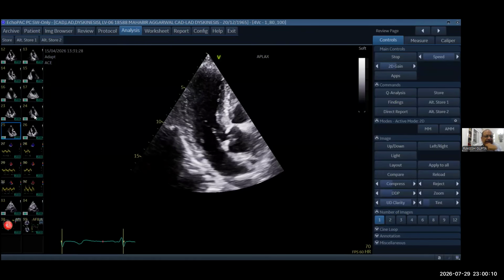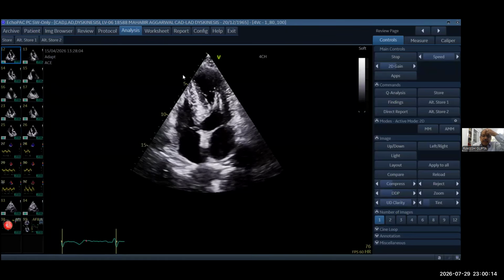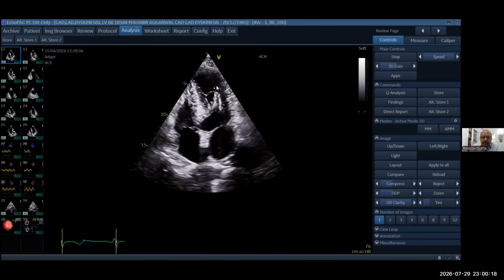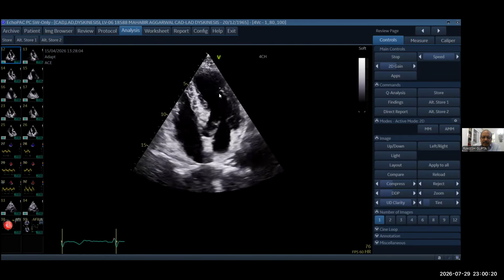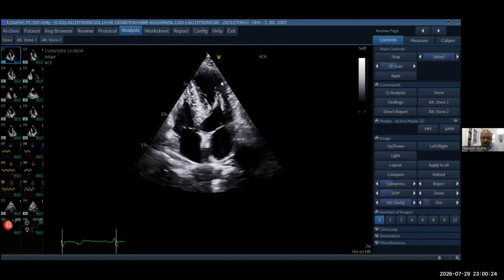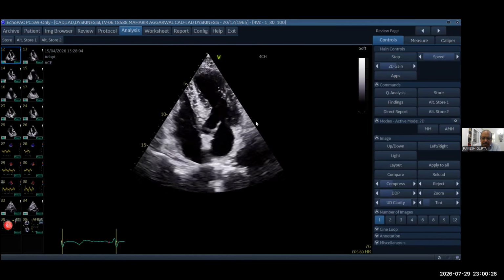This is apical akinesis. Now this apex is dyskinetic over here. Otherwise, the whole of this segment is akinetic. Like this is a cutoff line. Above that is hypokinetic to akinetic. Hypokinetic, this is contracting very well.